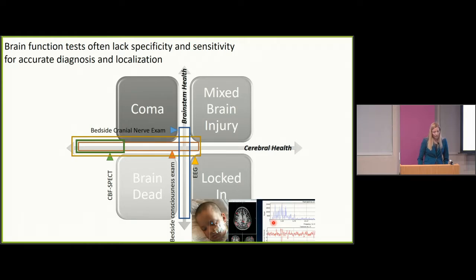So based on that information, he fits squarely in the locked-in syndrome category because he had default mode network intact and all of his major brain networks intact in this subclinical seizure. He was probably intermittently aware, which after he woke up, he reported things that indicated most clearly he was aware during a good portion of that time.